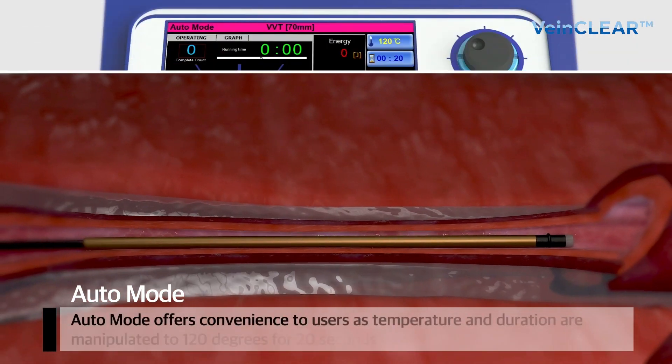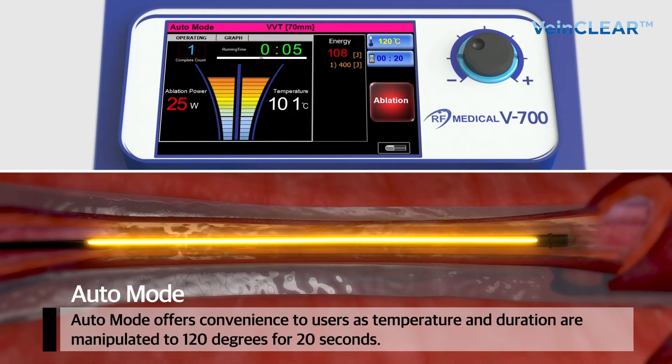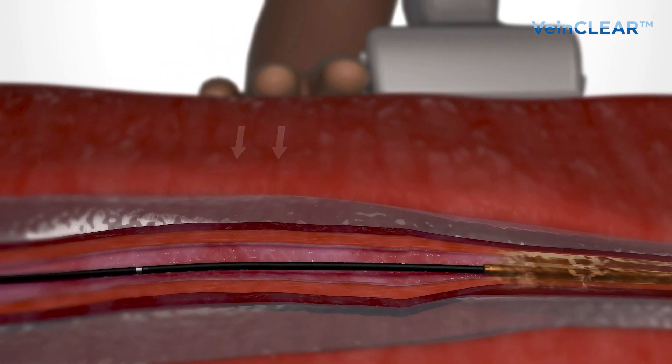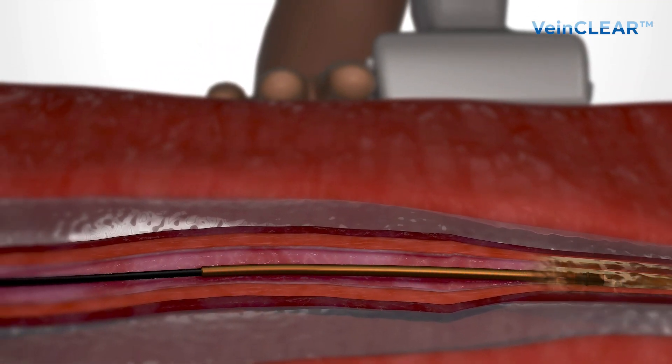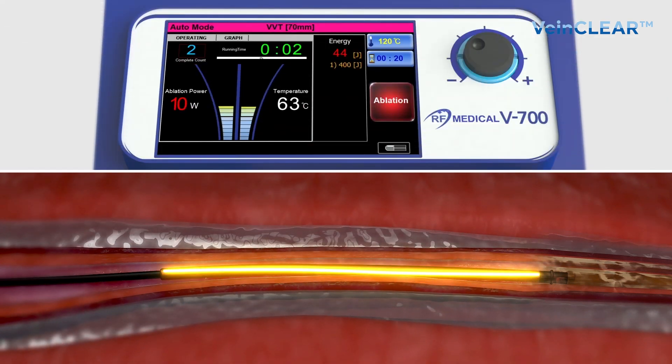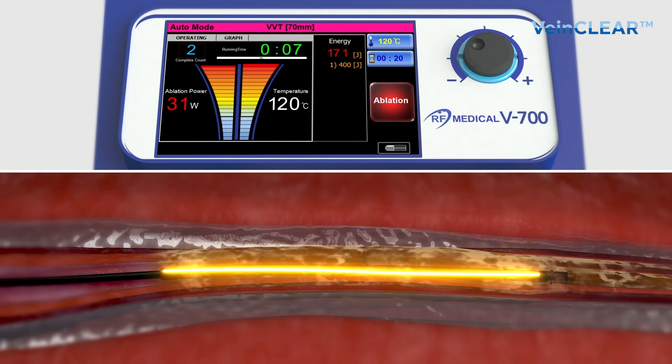Auto mode offers convenience to users as temperature and duration are set to 120 degrees for 20 seconds. The thermal ablation is performed at 120 degrees Celsius for 20 seconds while compressing with an ultrasound probe and fingers, such that the heating element and the inner wall of the vein are in close contact.